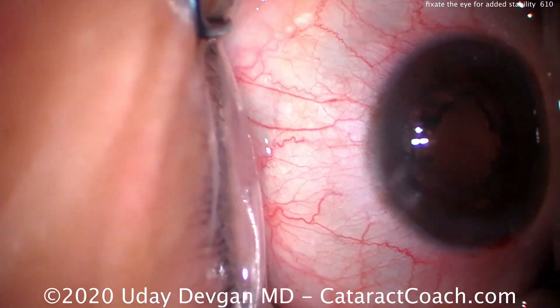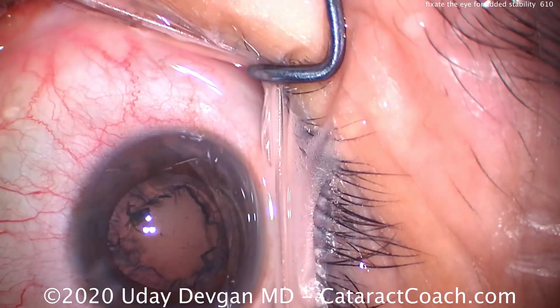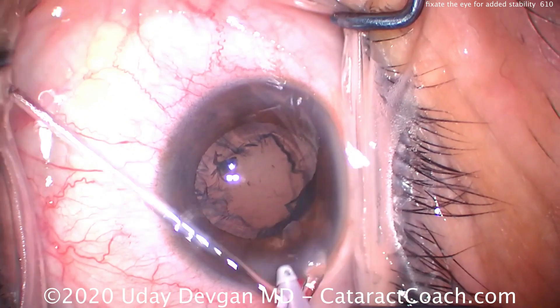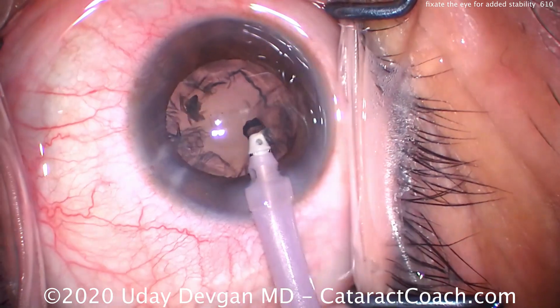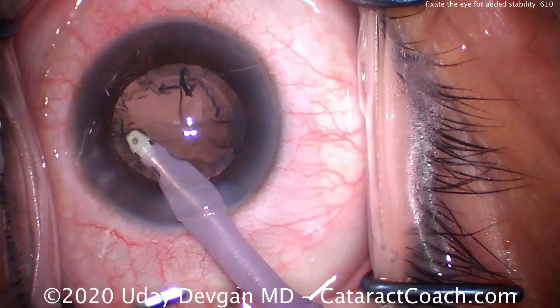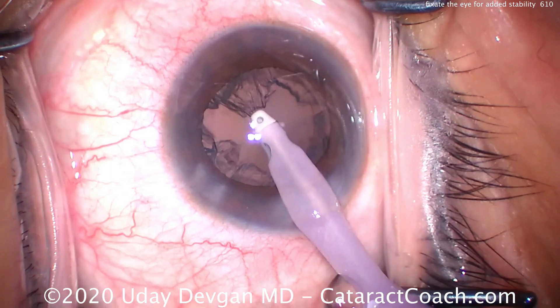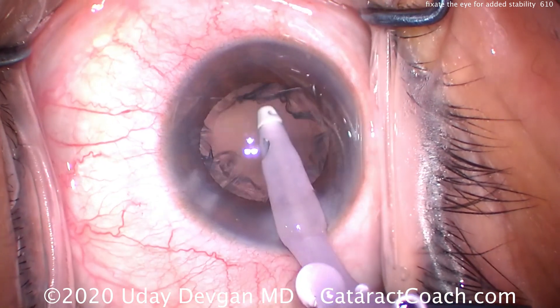You can see even more prolonged head movement — the patient moving the head around a little bit more. The patient doesn't mean to do this and is not even aware that she's doing all of this. With the intravenous sedation, which is primarily midazolam, this patient's not going to even remember any of the surgery.